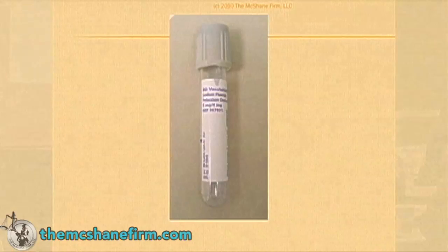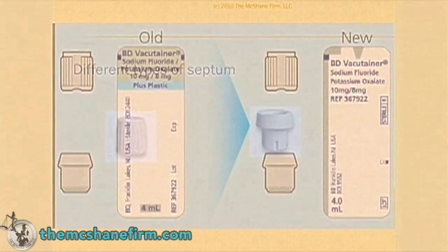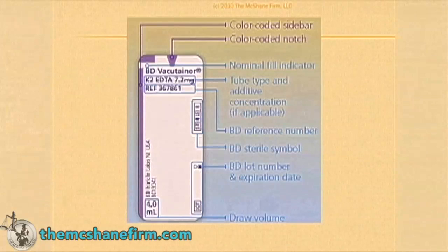There are additives that are inside of it. There's different enclosures that have to do with the difference of what's called the septum or the top. On the left is a hemoguard, on the right is a rubber septum. Okay, you can take a look and get a lot of information off of these tubes themselves and what they're supposed to have in there. There's a chart right here that you can take a look at your own leisure. It's inside of your materials as far as what it says, the proper draw volume, what it has inside of it, the color coding that represents there.